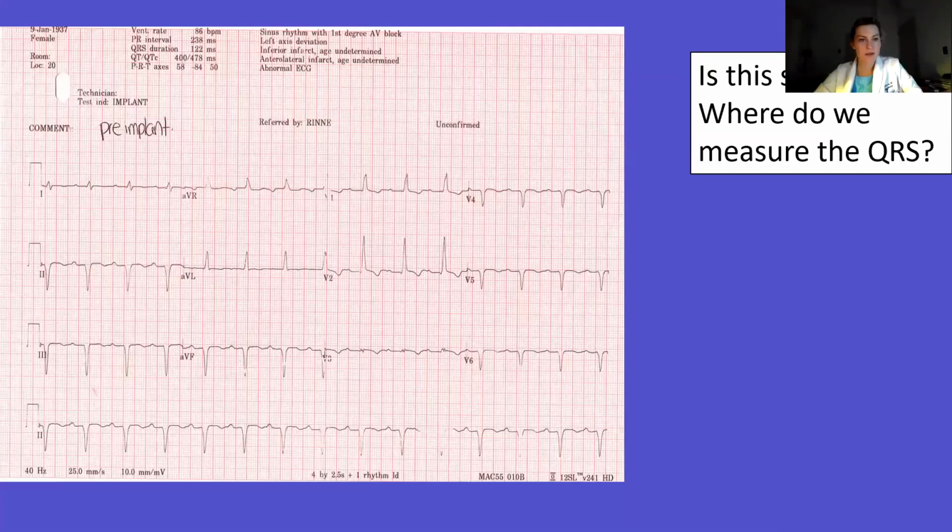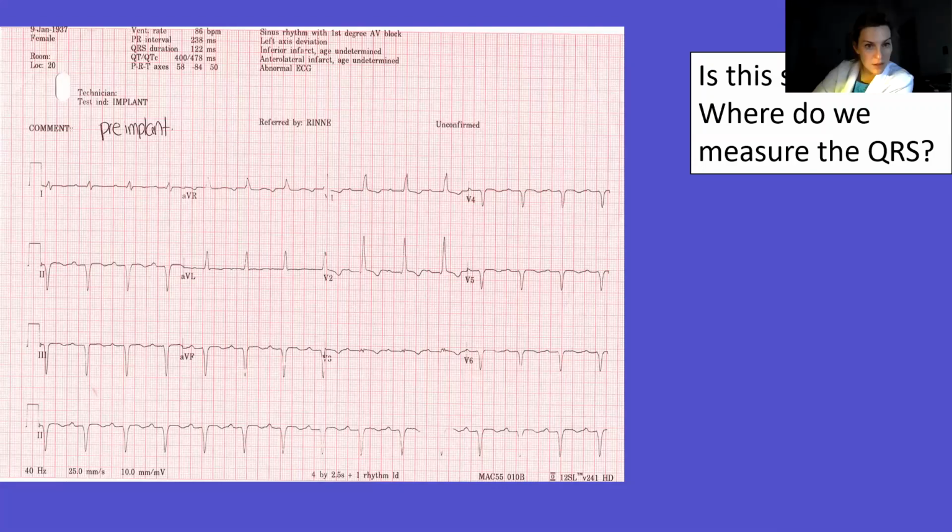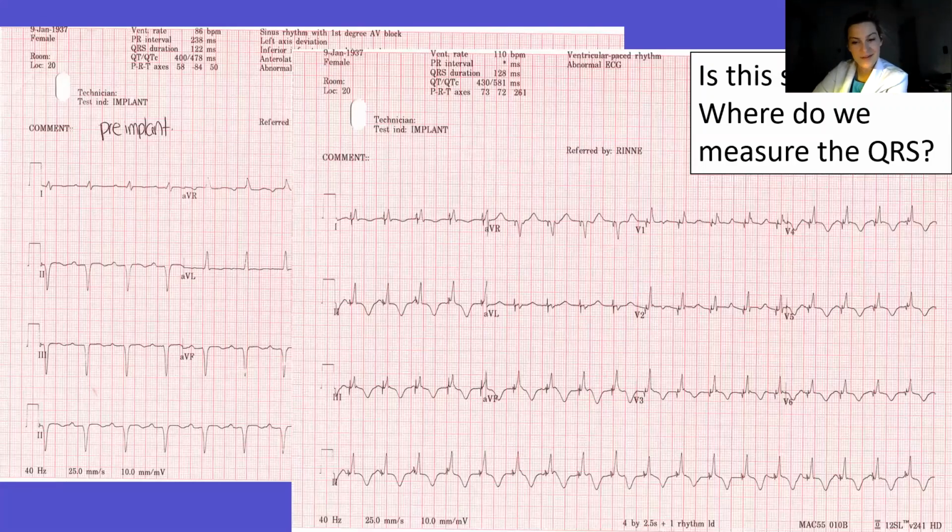And then there's a double ECG here. So this is a pre-implant. Yeah, this is somebody who had intermittent high-grade AV block. Great. And here's another beautiful ECG.